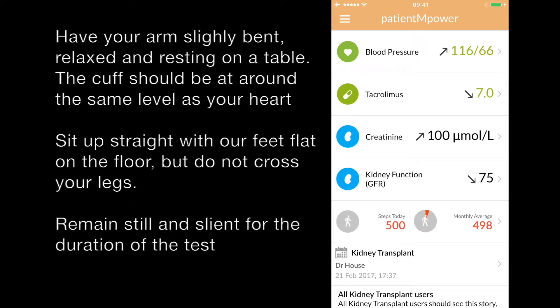Have your arm relaxed and slightly bent and resting on a table. Sit up straight with your legs on the floor, but do not cross your legs. Remain still and silent for the duration of the test.